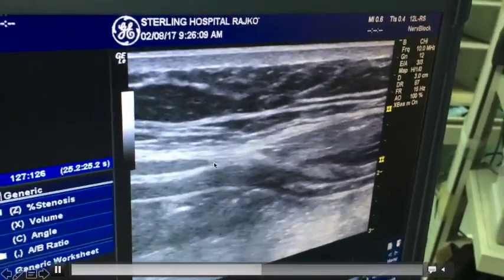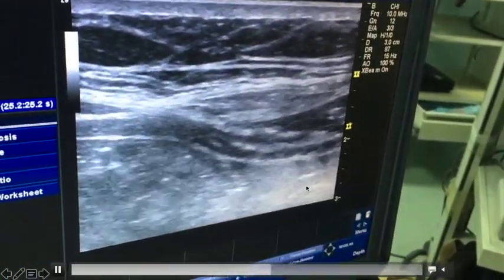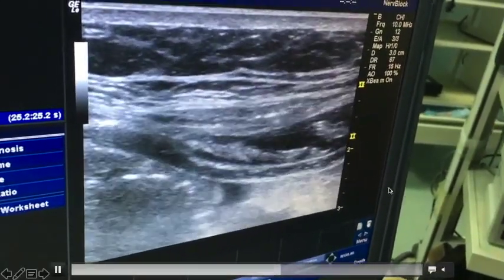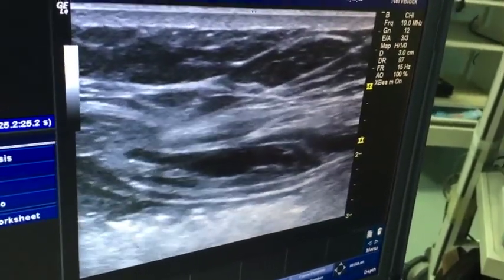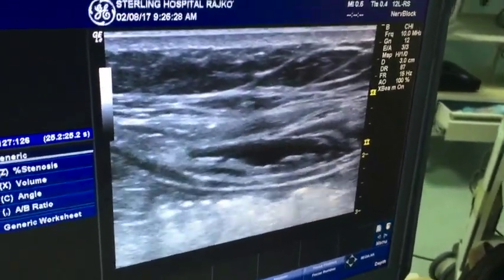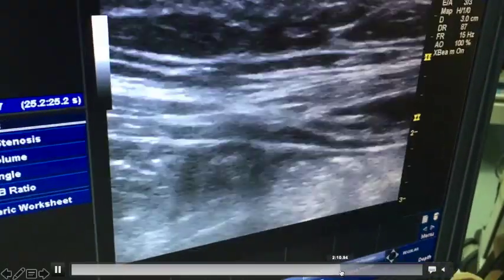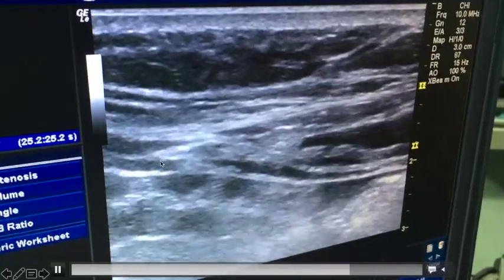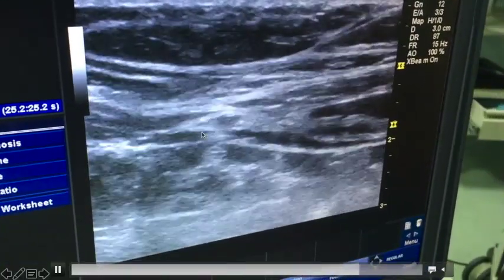So after injecting 5-7 ml of LA, I'll go further lateral to block T8 and T9 in the TAP plane. So this is for subcostal incisions or above-umbilicus incisions, to provide analgesia along with the rectus sheath block. After giving some drug there, now I am going further laterally in the TAP plane, and I will inject 10 to 15 ml of LA there to complete my block.